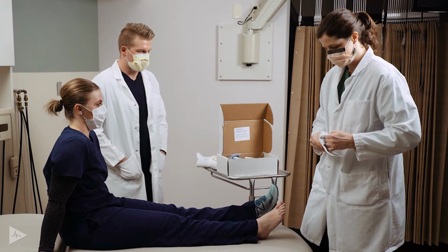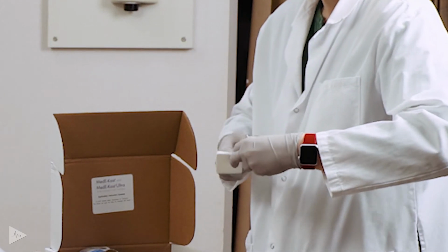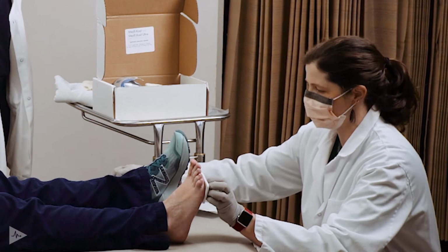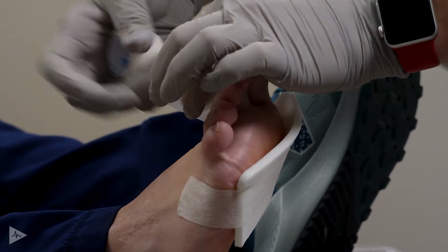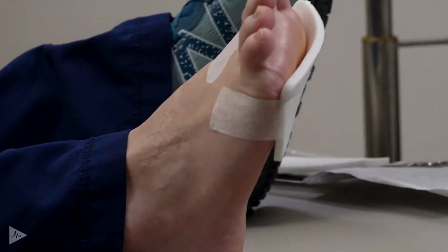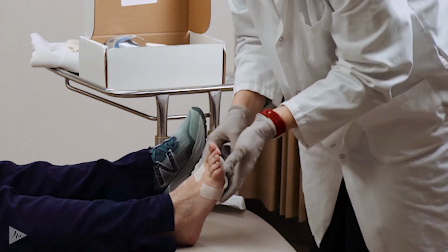We will demonstrate on a foot ulcer. So with the medical grade foam, you will want to trim that down to size for the ulceration. This will then be placed over the wound, and you use the paper tape to secure the dressing. You want to be sure when you tape this that the tape does not entirely come around the foot. So you always want to have a gap between the ends of the tape. And I always like to secure from 2 directions as possible to make sure that that does not shift.